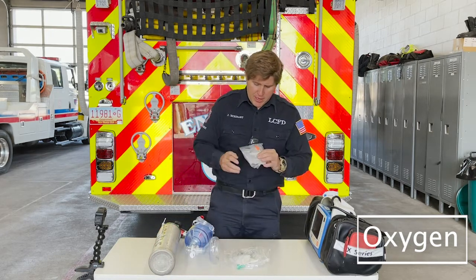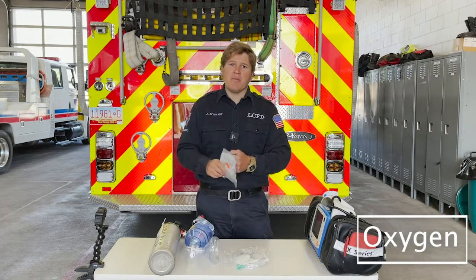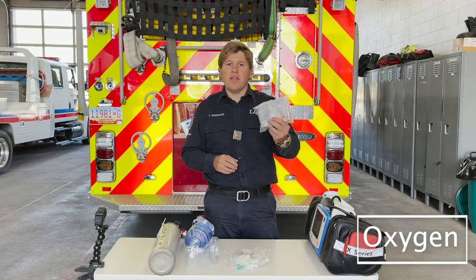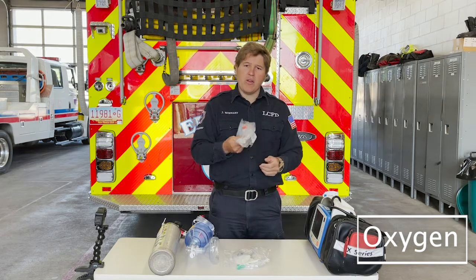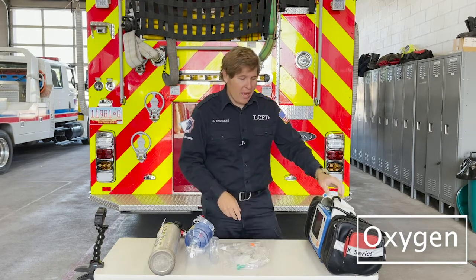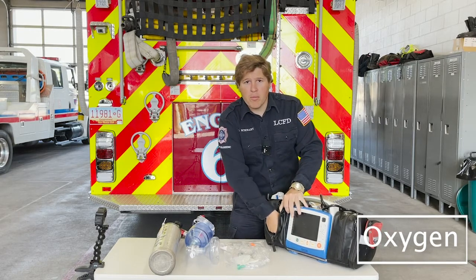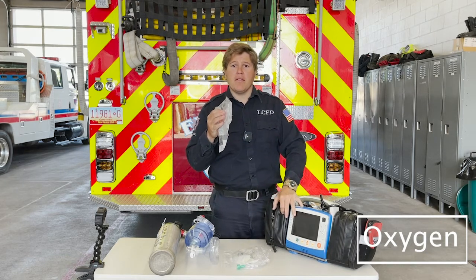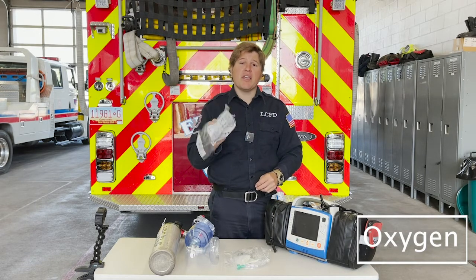And then sometimes people forget this: we always call for this after we've placed a tube. We hook up that BVM, we listen for those breath sounds, and then all of a sudden it becomes an afterthought of, oh, we need to hook them up to end tidal. Well, rather than doing that later in the call, have this ready to go. Have someone pull it out, and not only pull it out, but hook it to the monitor. Everyone should know that right here on the side, there's a little swivel door on the monitor. Have this hooked up and ready to go. That way, the minute that you're able to place that tube, this thing is on the BVM and picking up end tidal immediately.